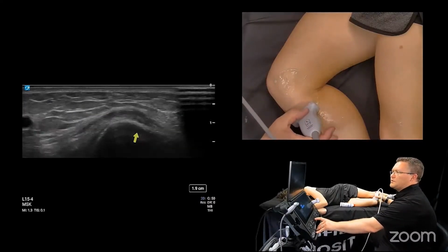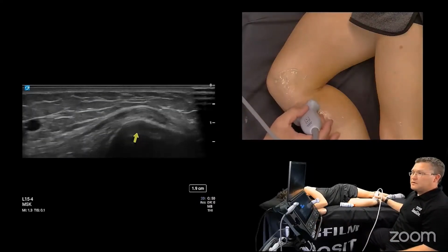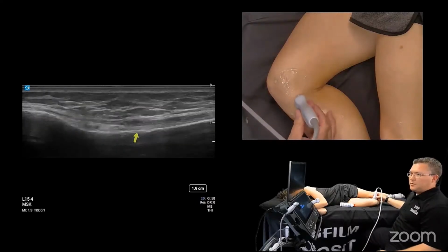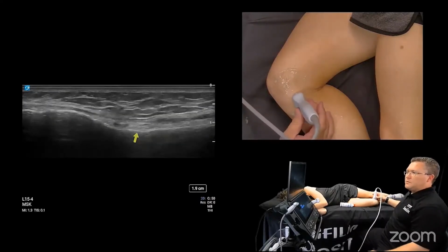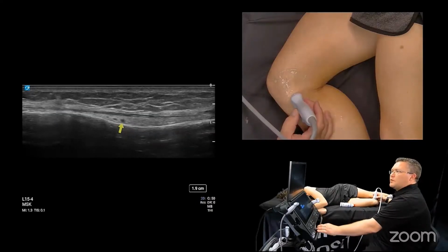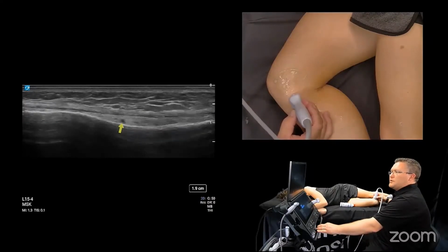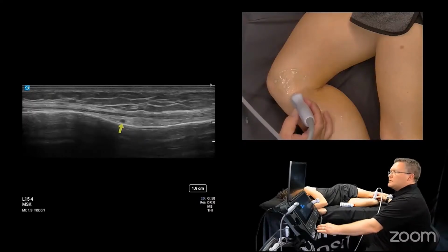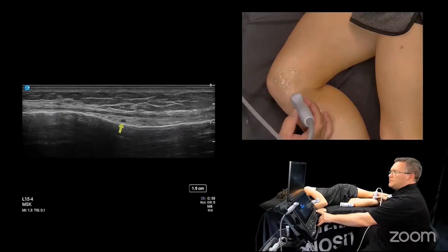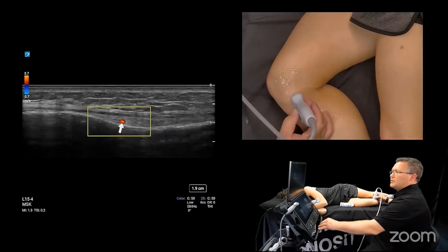Now, earlier I mentioned neurovascular structures on the lateral side of the knee, the inferior geniculate area. Here, just because we're in the neighborhood, we might as well point it out. Here's the inferior medial geniculate artery right there. So I know there's some pretty neat neurovascular procedures that are being done under ultrasound guidance, and it's very useful to be able to point out these vessels because they're roadmaps to the nerves, but also to point out what not to hit when you're doing procedures.